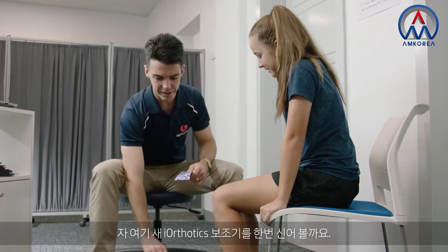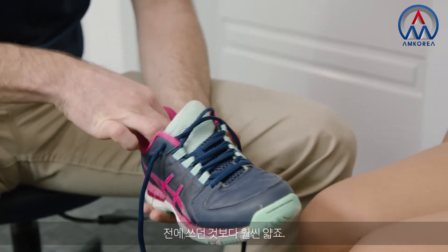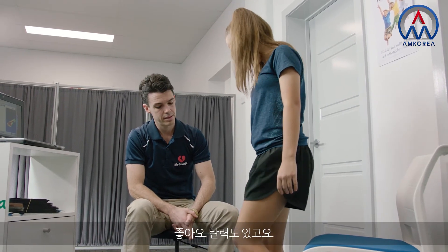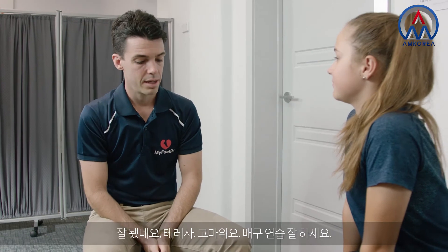I've got your new iOthotics here ready to go. It's much slimmer fitting than your old ones. How's that feel? Nice and squishy and bouncy. Nice and comfortable? Yeah. Okay, well thanks very much Theresa. Good luck with the volleyball trials.